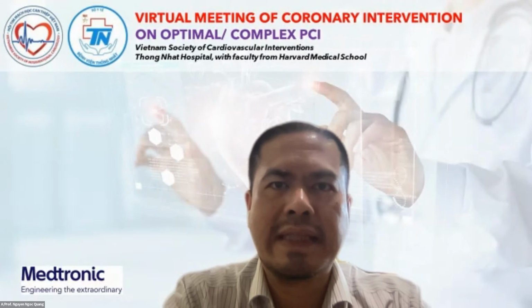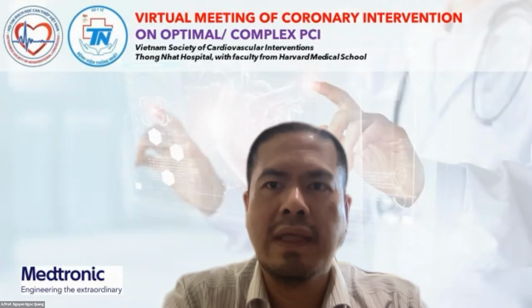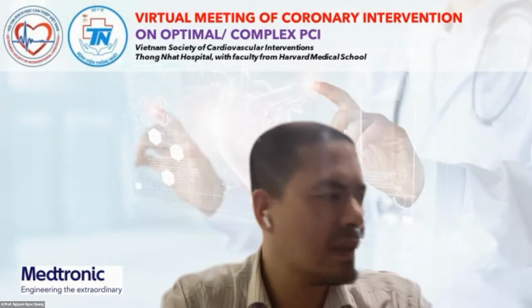Professor Tan, can you suggest one practical answer for our audience? Which type of device should you use for complex PCI in daily practice?